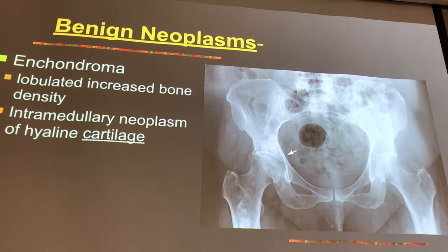I got one yes. Are we changing? I would say yes. kVp, yes. Yes. It's got increased bone density, yeah, right? That's true. But we did a pelvis. And what's the percentage of bad juju to the image? Just one small area.